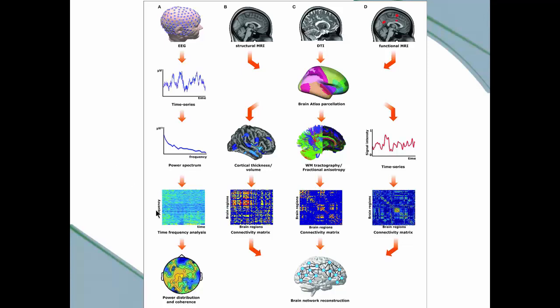Here we have what's also called a time frequency analysis. This is something that you can see very readily as we use Mind Monitor with the Muse 2 headband. We'll also be able to construct power distribution and coherence analyses to an extent with another program that I will show you shortly. That program you may or may not want to use. We'll talk about that later, but I'm using it for additional analysis and for additional show and tell. I'll show you that in a minute.